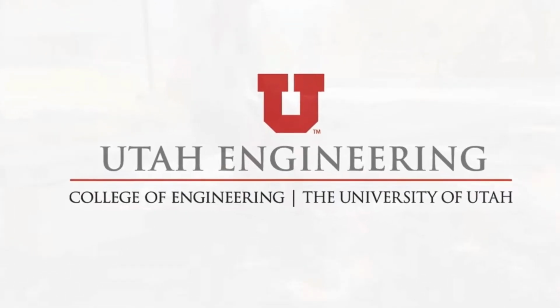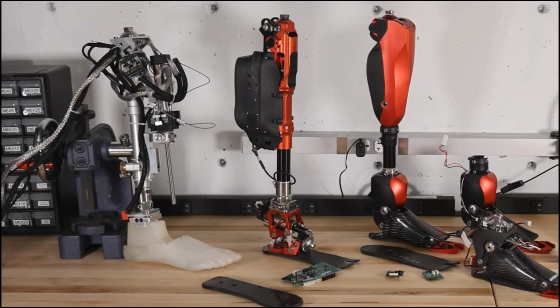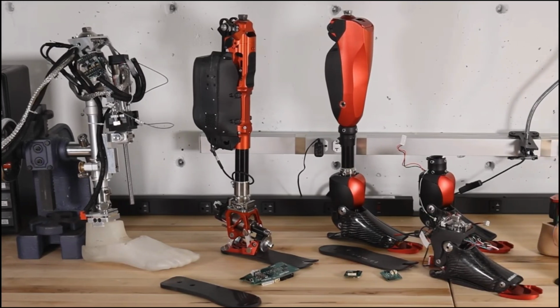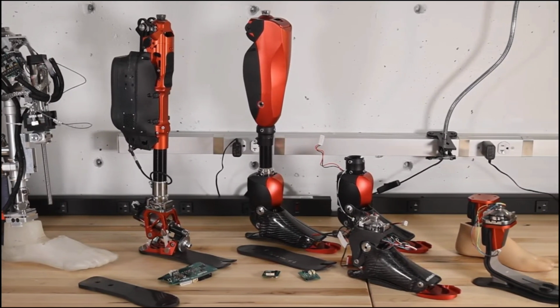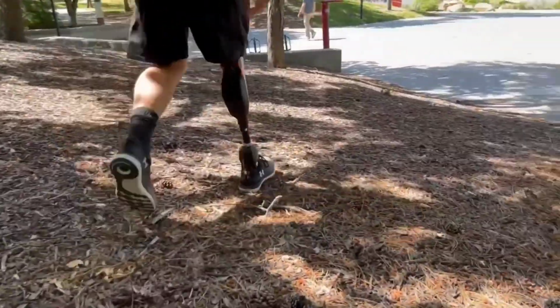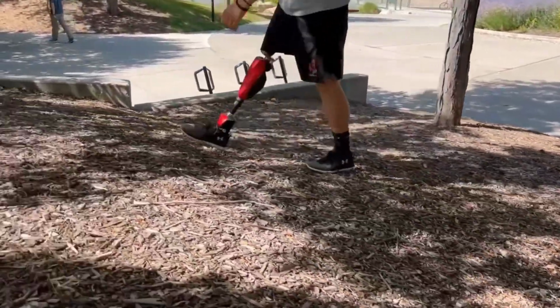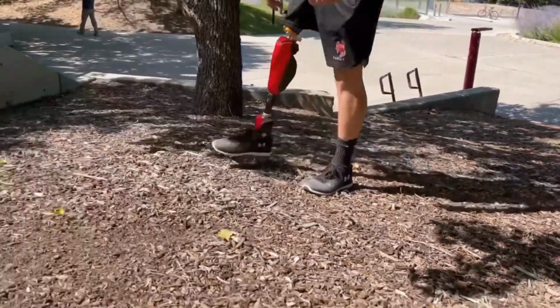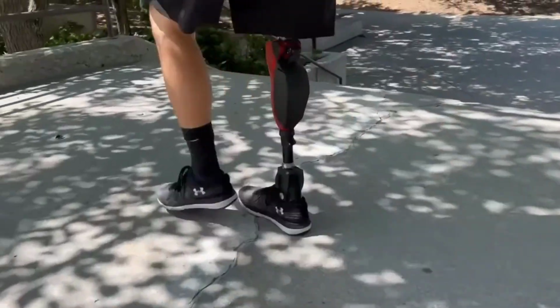Next is the Bionic Leg, made by the University of Utah. Tommaso Lenzi, an associate professor of mechanical engineering at the University of Utah, and his students created the Utah Bionic Leg, a motorized prosthetic for amputees of the lower limb. By developing prosthetics that can think independently, the University of Utah is adopting a totally different strategy. Given how quickly robotic and AI technology is developing, they incorporate it into amputee prosthetics as well.